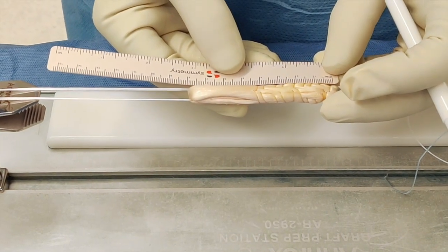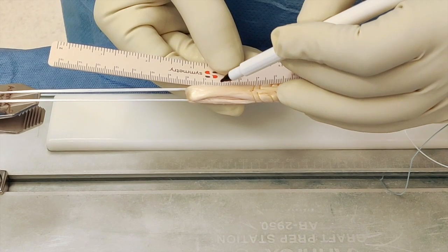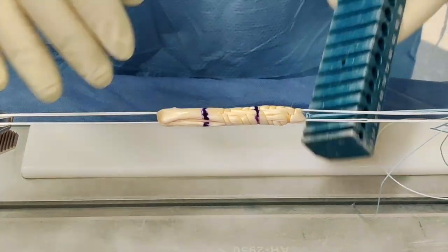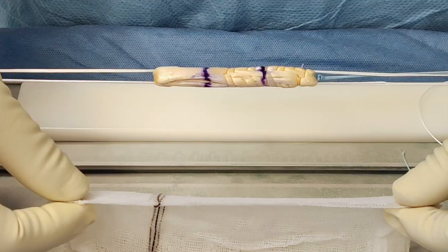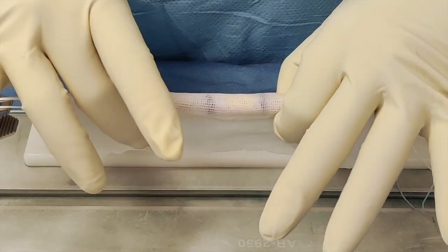I mark the graft length and it's measuring 7.5 cm. I take into consideration the depth of my tunnel — I measure 2.5 cm from one end and 2.5 cm from the other end. Sizing the graft, this looks like around 10 mm. This is a very good size. We have finished preparing the graft and we leave it in antibiotic-impregnated saline solution.